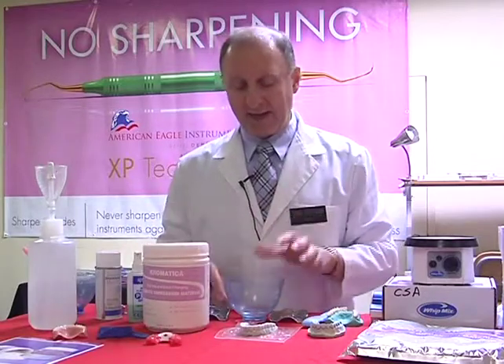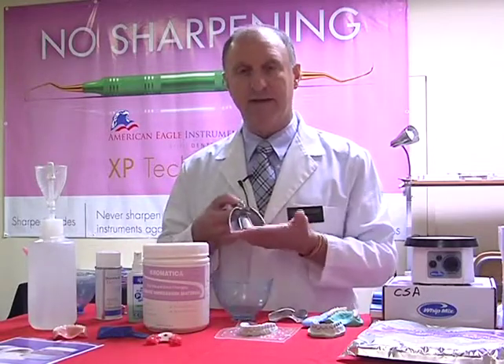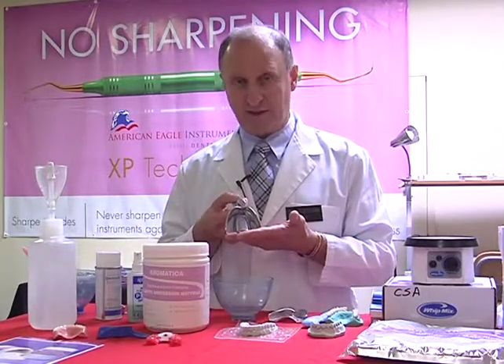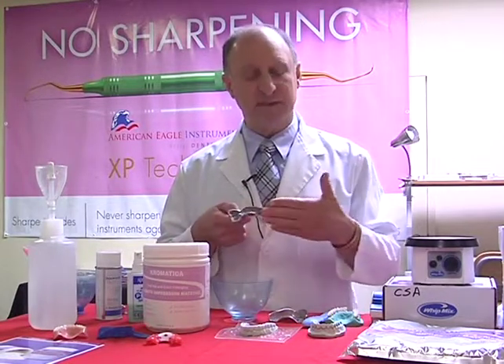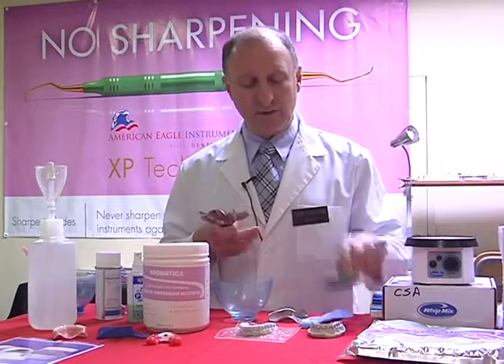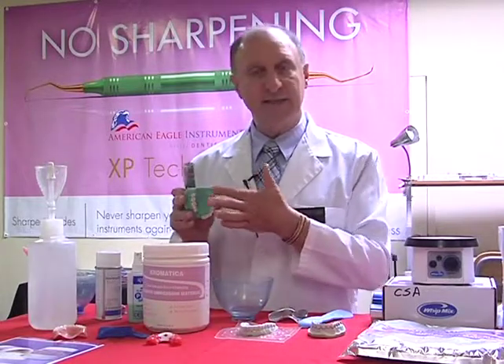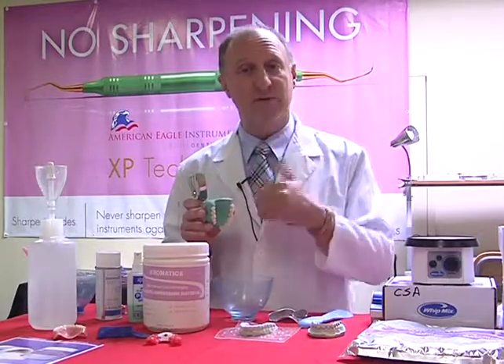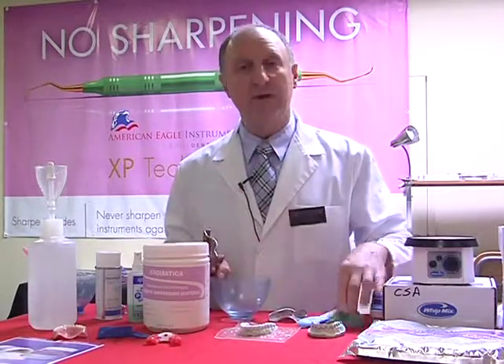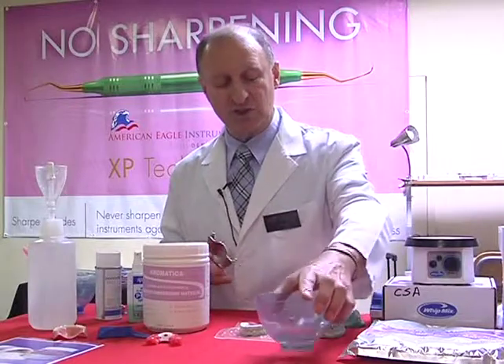I'm going to be using our impression tray, which is the solid tray. But instead of using wax at the posterior borders to dam it in, which, if I didn't do, the distal area would be lost as the material flows out the back, down the throat and onto the tonsils, we want to stop that from happening. So let me show you what I'm going to do.